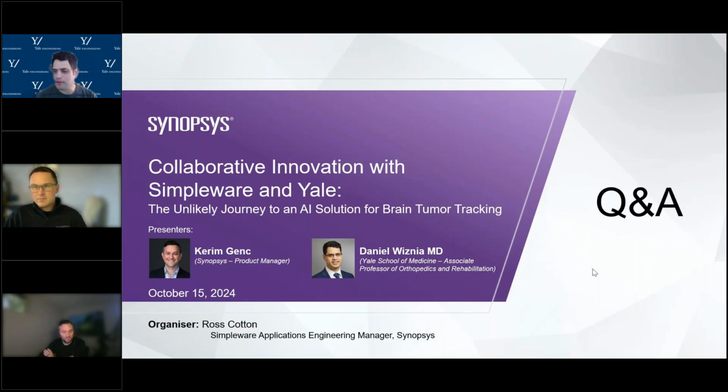Yeah, I think the first thing, and this is just the most obvious, is make sure you can get enough images. I would start small, collect images locally at your institution, and then manually segment those and get a good sense for the size and extent of these tumors.